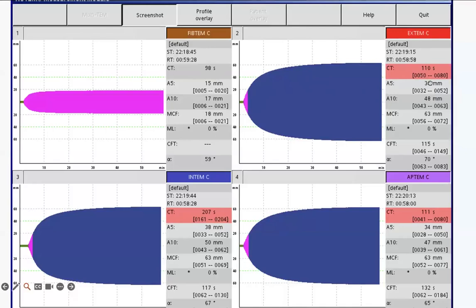So 20 or above is okay. There is some or good platelet function along with good fibrinogen function. But what's happening here? On top of this, there is derangement of clotting time, which is evident in EXTEM and also in INTEM and also in APTEM. That means clotting time is deranged in spite of a normal fibrinogen and possibly a normal platelet.